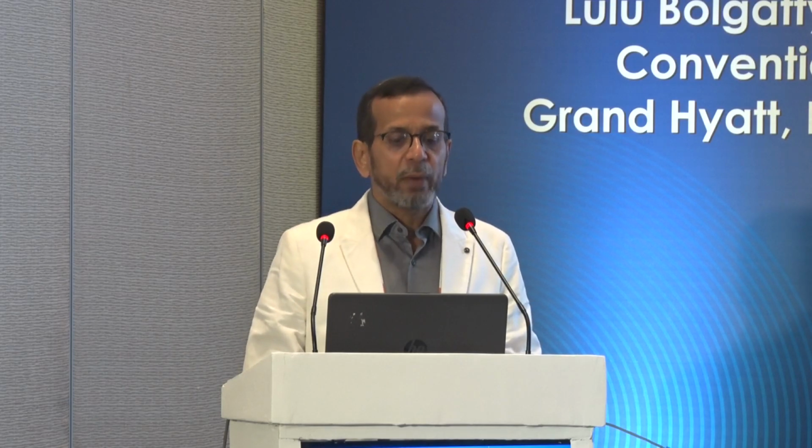Now, in phacoemulsification, ideally a hard cataract should be done within the bag. It prevents the likelihood of the nuclear fragments going behind, but there is a lot of chance of damage to the bag or zonule, so one needs to pay particular attention to where the fragments are and where your tip is. In case of a soft dislocated or subluxated cataract, one can emulsify it into the anterior chamber.